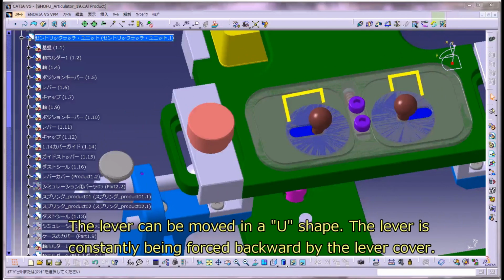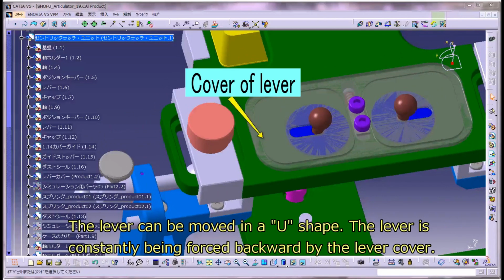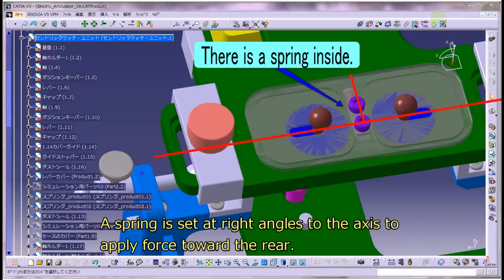The lever can be moved in a U shape. The lever is constantly being forced backward by the lever cover. A spring is set at right angles to the axis to apply force toward the rear.